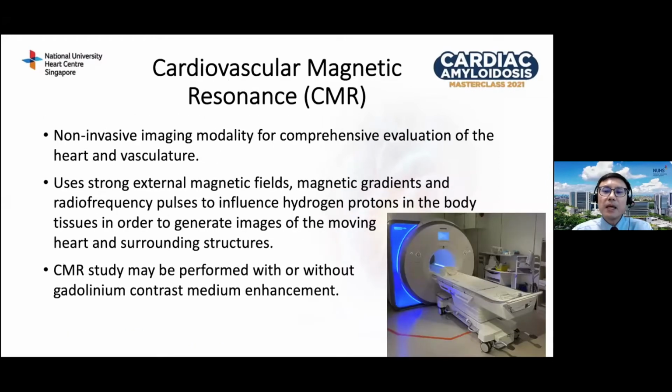I'm going to talk a little bit about CMR, cardiovascular magnetic resonance, in case some of you are not familiar with this imaging modality. I'm sure all of you know about MRI, but you may not be familiar with MRI being used to image the heart. MRI is a non-invasive imaging modality, and with modern scanners and techniques, we can use MRI for a very comprehensive evaluation of the heart and the cardiovascular system.